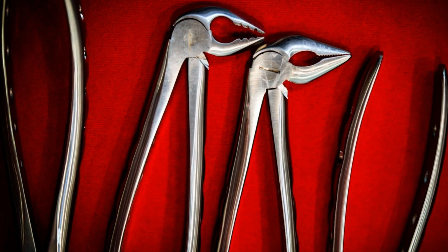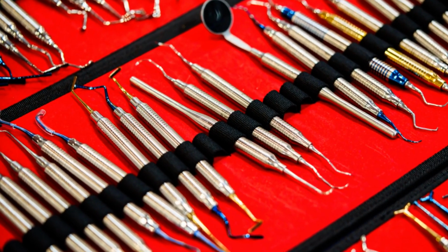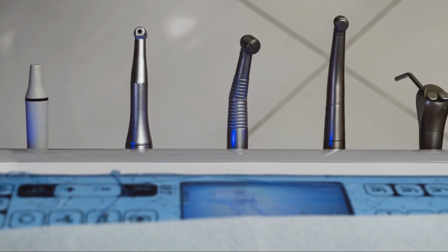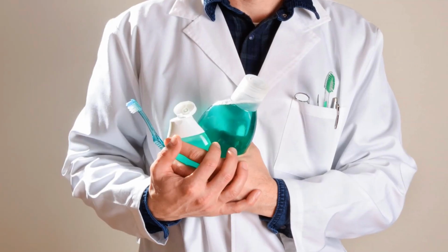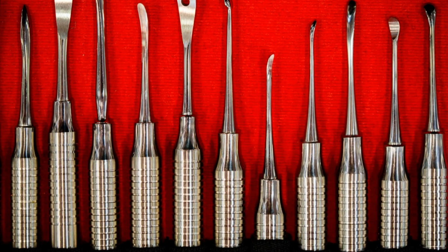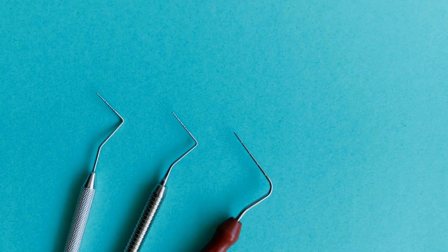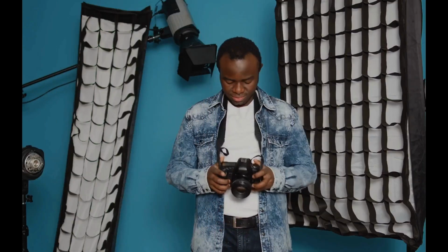Remember that the polarizing filter on your light source is equally important as the filter on your camera lens. Ensure that both filters are of comparable quality and effectively block unwanted reflections. The combination of a high-quality camera lens filter and a light source filter is crucial for achieving the full benefits of cross-polarized photography, maximizing clarity, detail, and color accuracy in your dental images.